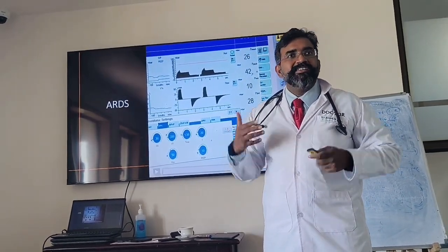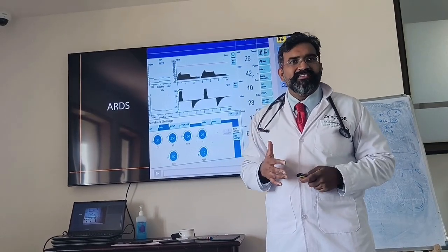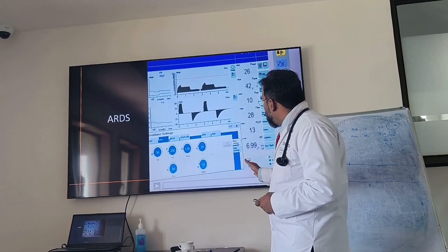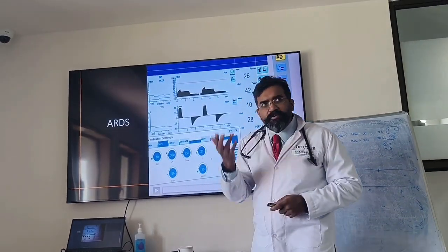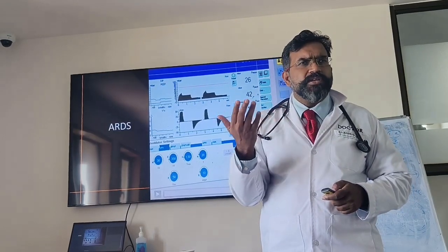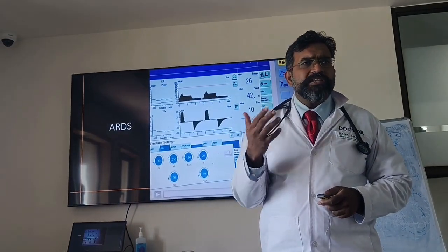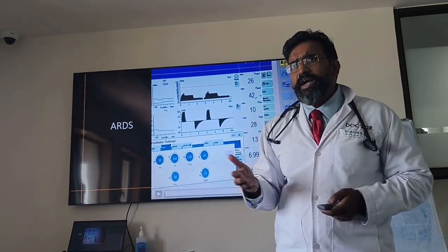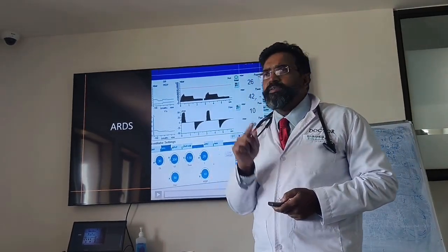You cannot just set a tidal volume and a respiratory rate. If you have all your parameters in place, you will notice the differences and then you will adjust the ventilator in such a way that you are being as physiologically good as possible and at the same time as less injurious as possible. And to do that, you need to touch each and every button.